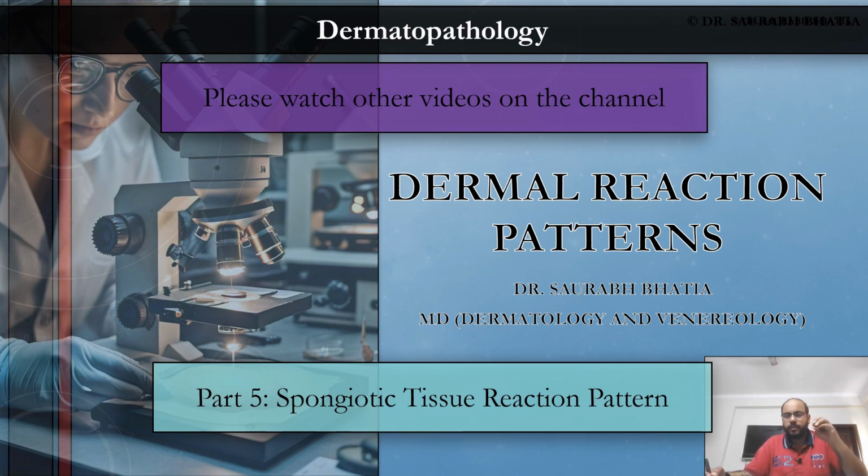Now, why do we have spongiosis? There can be multiple reasons for spongiosis, but the end result is the same. It is just intraepidermal edema or intraepidermal extravasation of fluids. Okay. And because of the fluids, the keratinocytes will move away from each other. They will be separated out a bit, leaving behind little holes or transparent areas. And the epidermis then looks like a sponge. And that is why it is known as the spongiotic tissue reaction pattern.